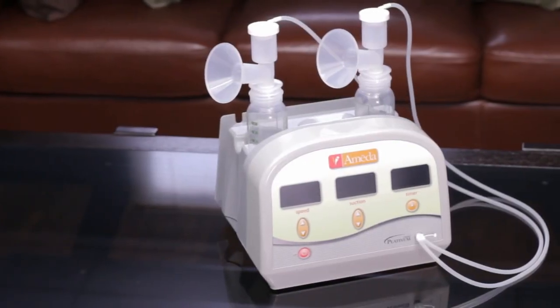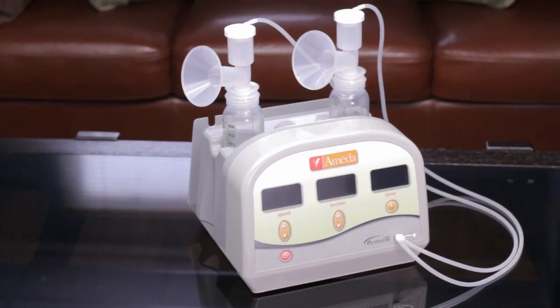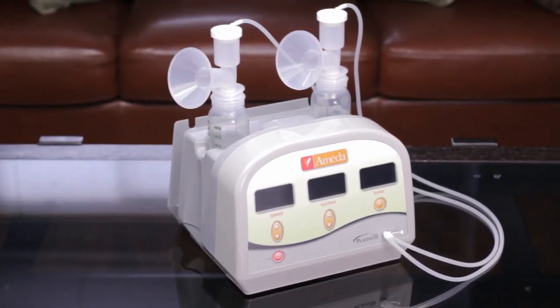Customization and safety are at the heart of Ameda's commitment to mothers. The Ameda Platinum Hospital Grade Breast Pump provides both innovative features and advanced technology.